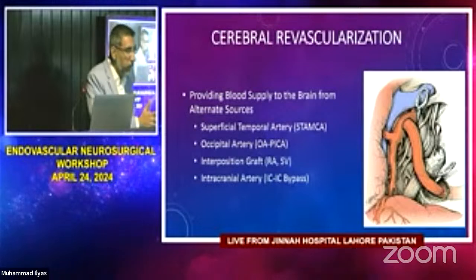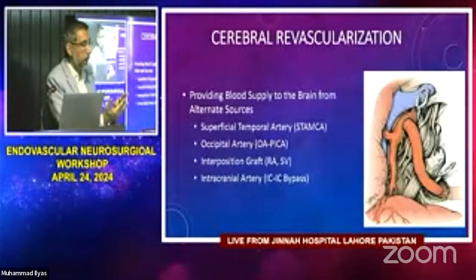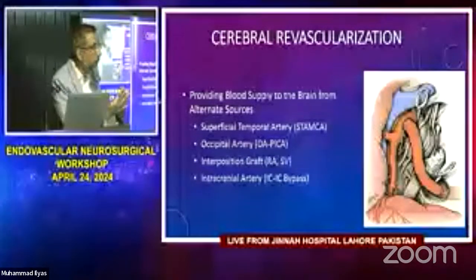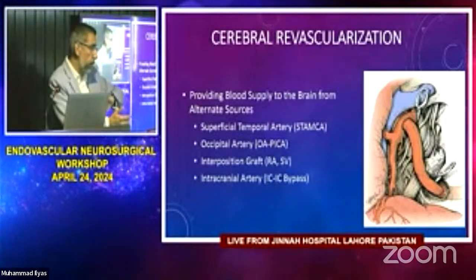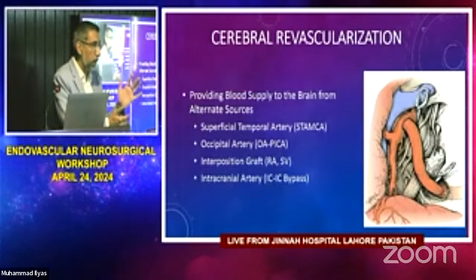The next is flow diversion, which is more like a mesh, so to speak, but the metal coverage is still about 30 to 40%. It's not complete. So there are still holes, but they're very, very tiny holes. You cannot get your wires or catheters through it. Once you put a flow diverter across an aneurysm, you cannot get into the aneurysm. There's no way you can get into the aneurysm, right?